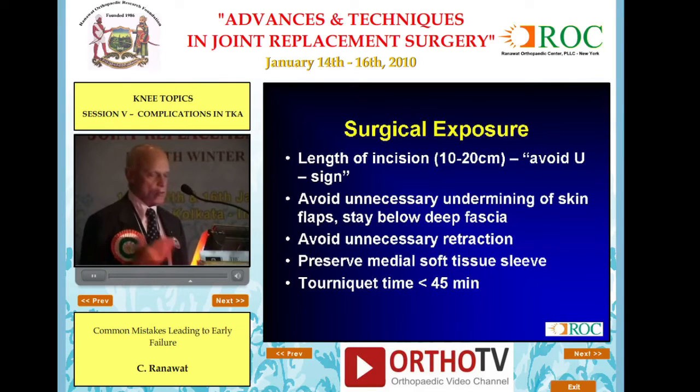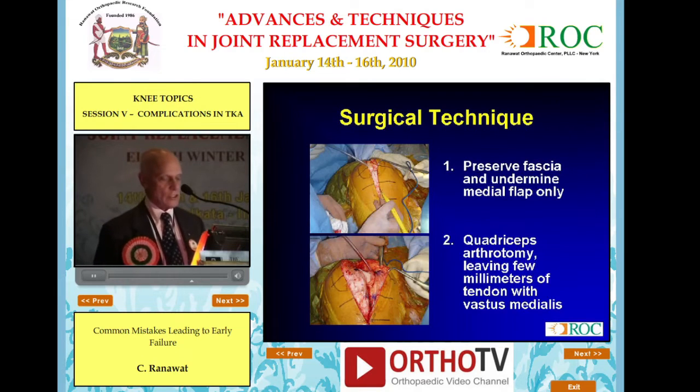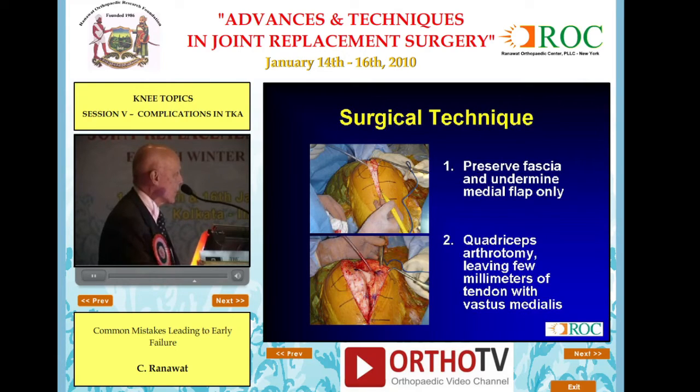Surgical exposure you have seen before, so I will not spend my time. You do the operation in flexion, and here it is. You should not cut the quad here. When you go from here, you should go straight. Don't go that way.